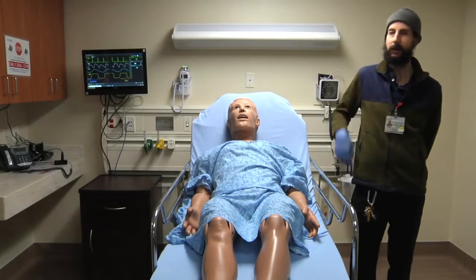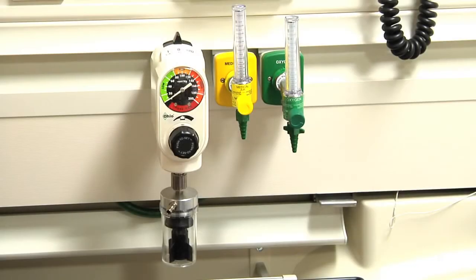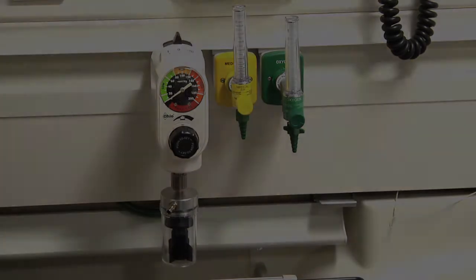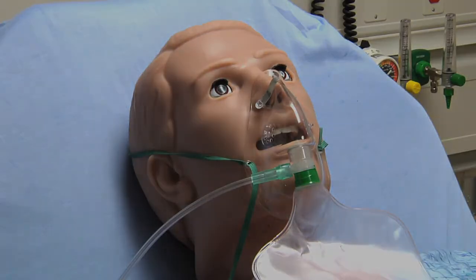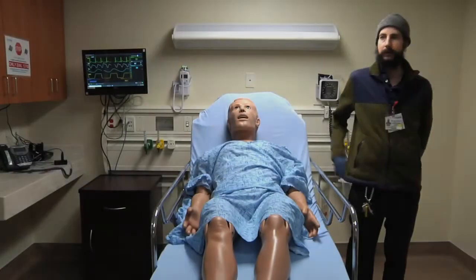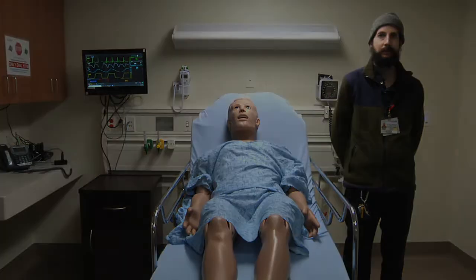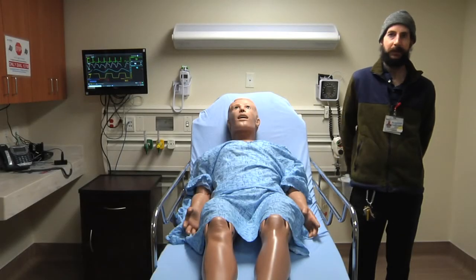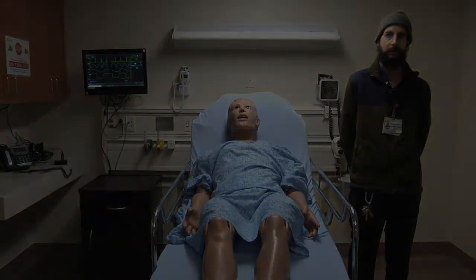So we have functional head walls down here in the Sim Center. So we have oxygen, medical air, and suctioning. So if you are to administer oxygen, go ahead and turn that flow meter on. So any airway equipment will be provided for you by the Sim Center. So your patient will be speaking to you or not speaking to you, depending on his patient condition.